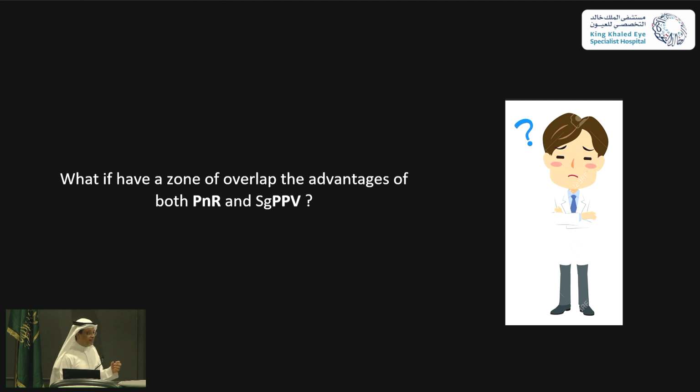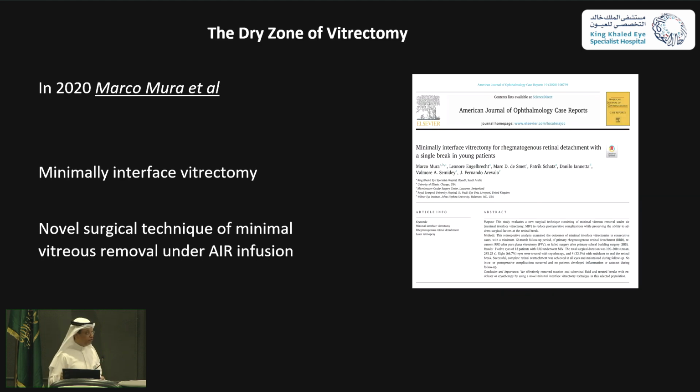Okay, now let's think in a different way. If we have a procedure that has the advantages of pneumatic and the advantages of vitrectomy together, and can avoid some of the complications, would it be fine? Yes or no? Yeah, of course, yes.